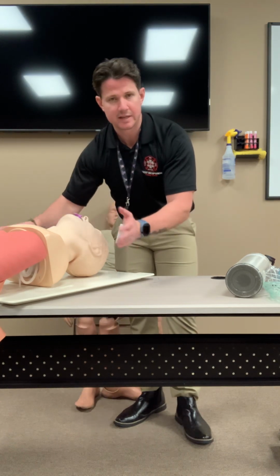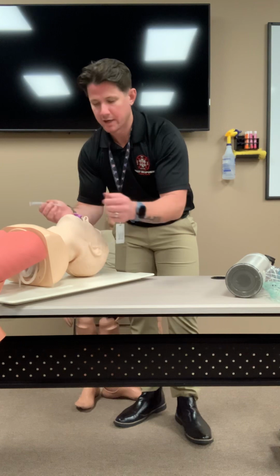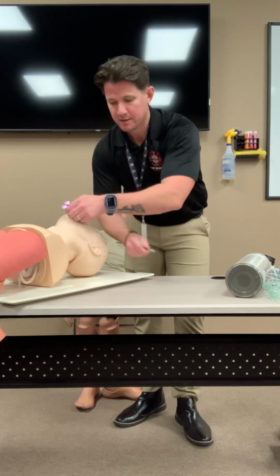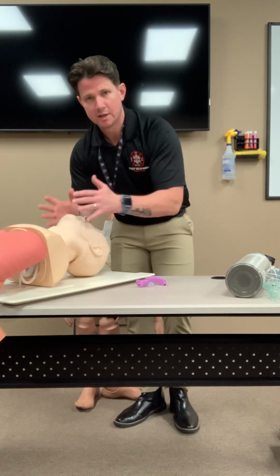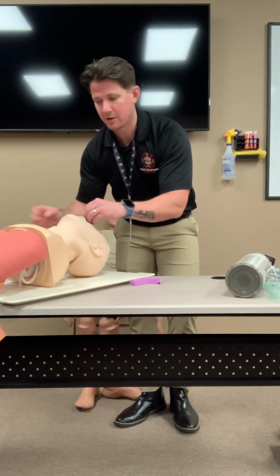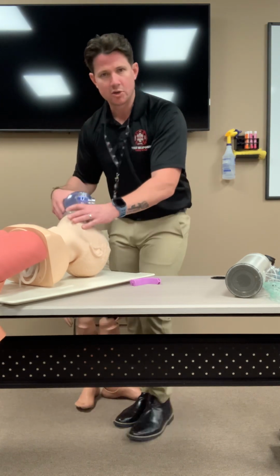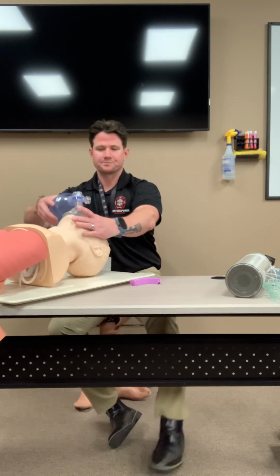If he has a gag reflex, no big deal. Take this out, put the NPA in, right? If he has a gag reflex and he starts vomiting, take this out, rotate the patient to their side, go through the suctioning I just showed you. When you're done suctioning, okay, the patient is now suctioned. Let me throw my NPA in now, and I'm going back to bagging, right? No big deal, guys. You guys know what to do. You just have to do it, right?